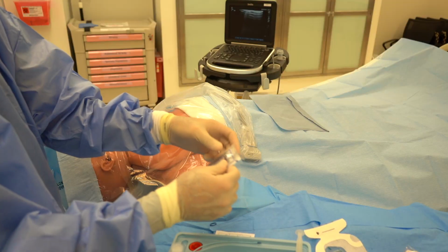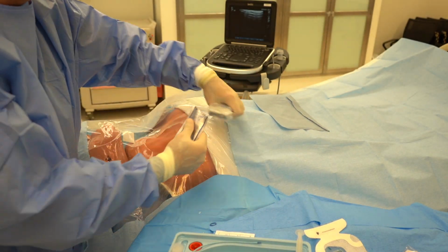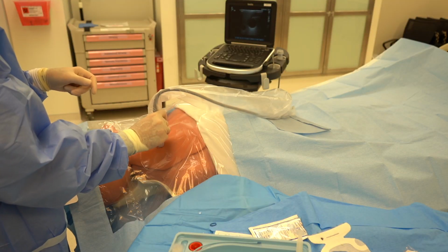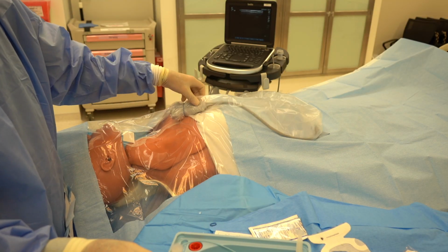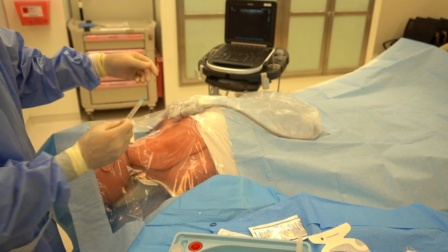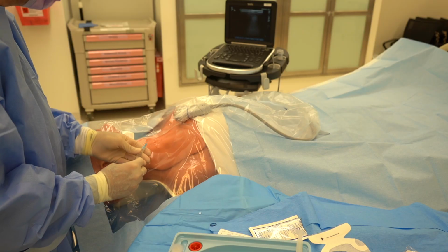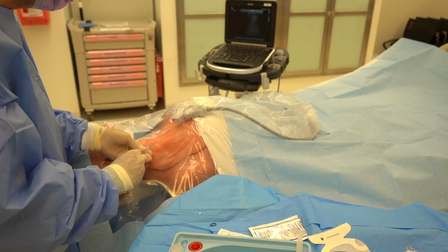And now we're ready to proceed with evaluating our site to assure that we have our drape in an appropriate fashion to allow us to have access to the vessel, but also allow for visualization of the wire after insertion. So here we can see a good orientation of our internal jugular lateral to our carotid. We have our site marked. We're going to use some lidocaine here, using the ultrasound to get a sense of center. Drop that probe, nice lateral approach here, notify the patient of a potential stick here and some burning.